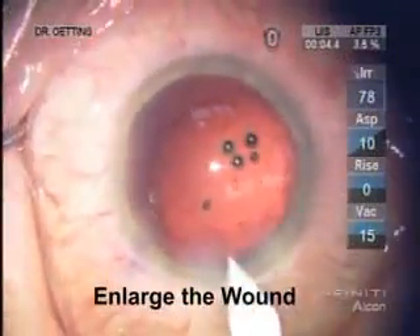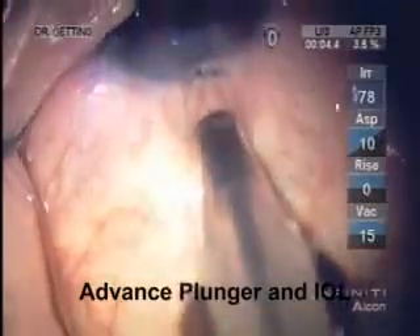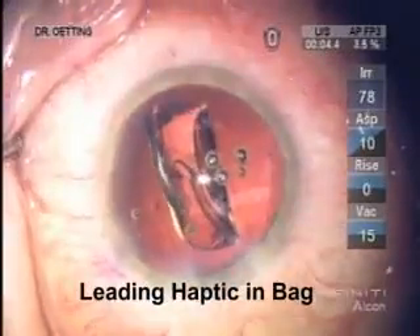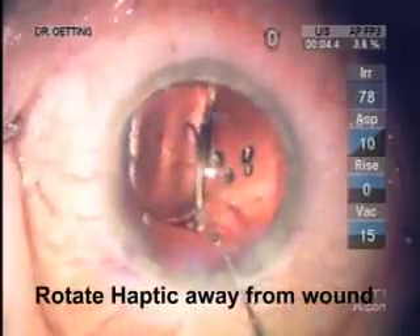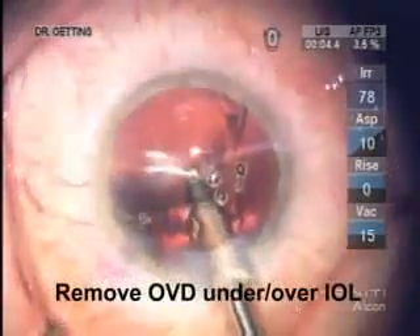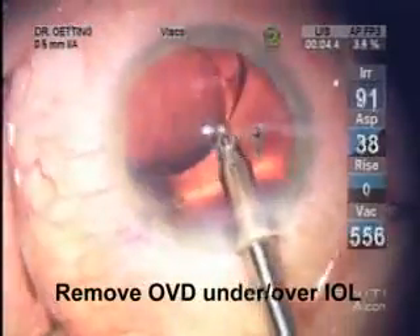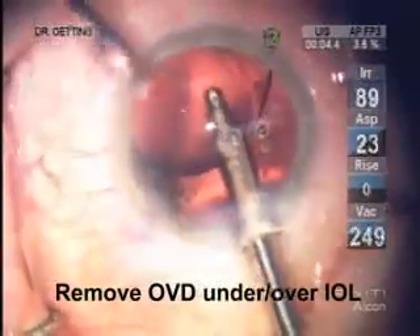Sometimes the wound needs to be enlarged a bit to get to about 3 millimeters or so for this system. Here you can see the ocular lens is going forward. The leading haptic is just under the anterior capsule and in the bag. Now a Kuglin hook is used to rotate the lens so that both haptics are in the bag and it's about 90 degrees away from the wound. This allows you to place the irrigation aspiration unit under the intraocular lens easily to remove the OVD below and above the intraocular lens.